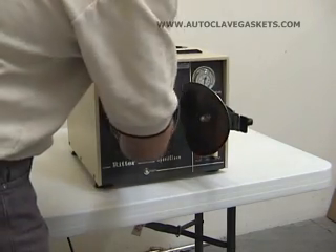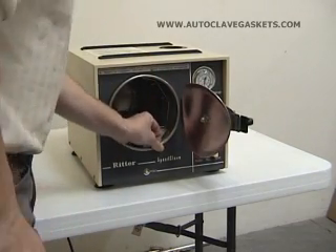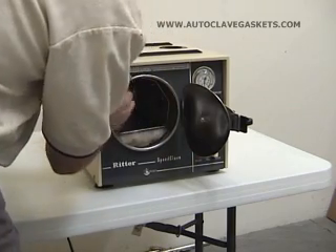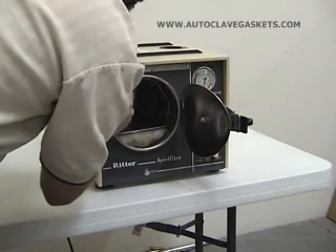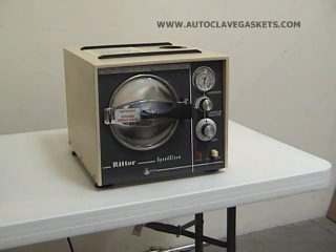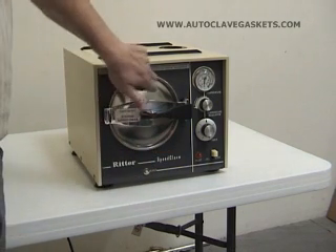Just like that — go all the way around it. You might have a couple of places where you've got to knead it down to keep it straight. As long as it's up into the groove and nothing's sticking out, you're pretty good. Once you get it in there nice and good like that and bring the door closed, that's going to push the rest of it up into that groove anyway. The first time you cycle it, once the pressure builds on it, you're going to get a nice tight seal around the inside of the door against your gasket.